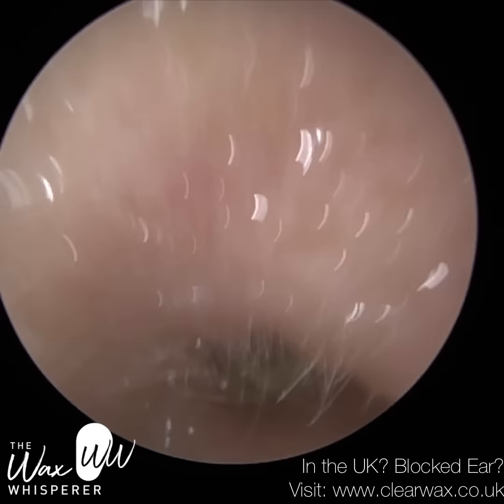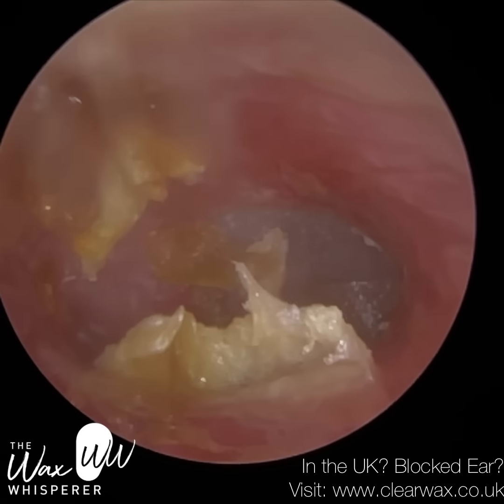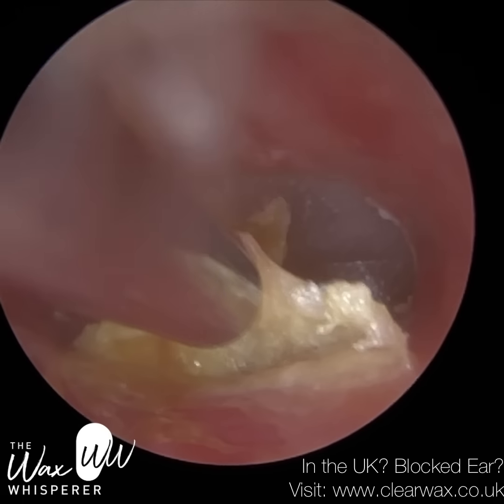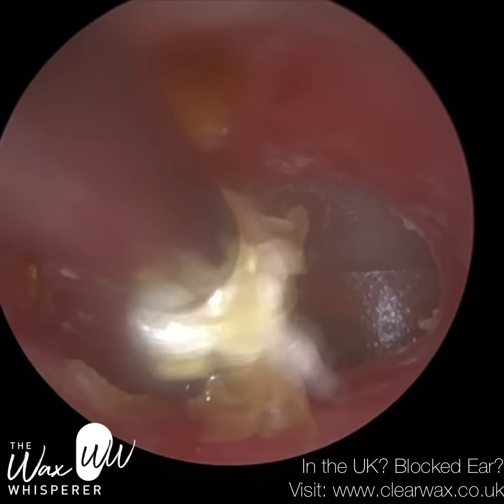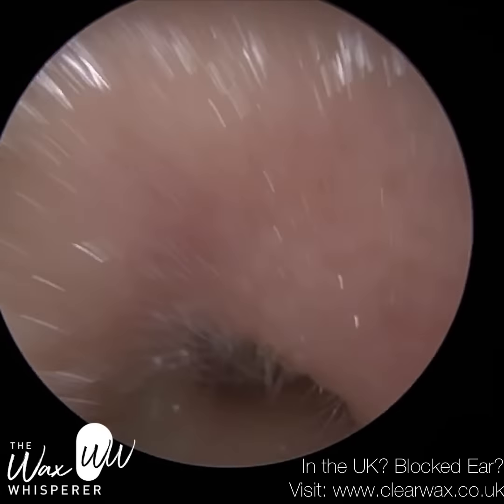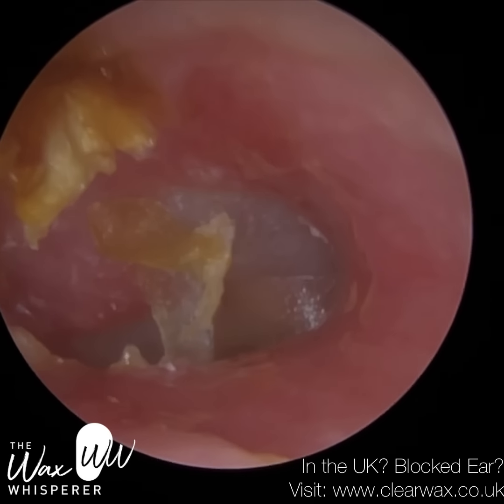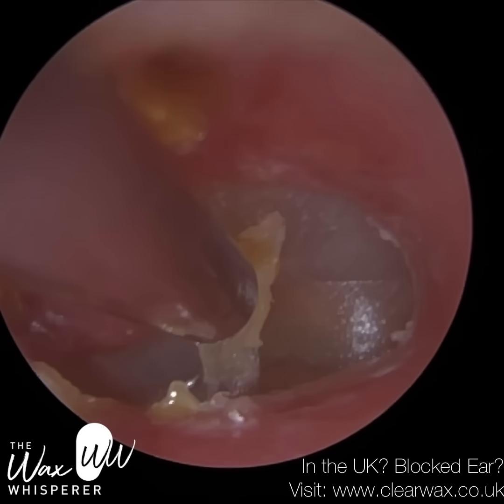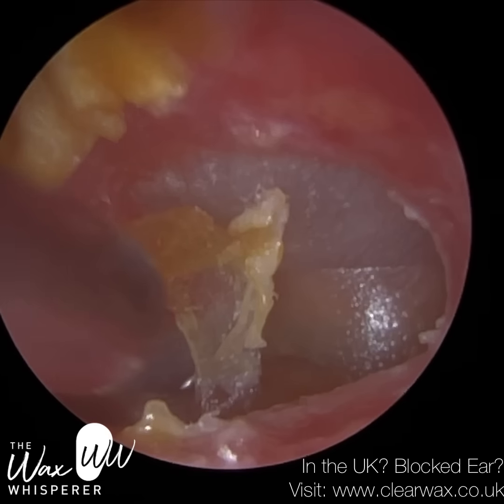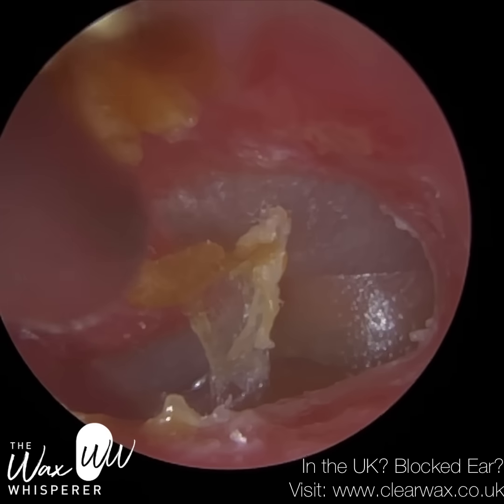I managed to remove it, and you can see it's coated with this dead skin. That dead skin, the rest of it had still remained on the ear canal. So it almost sticks to the ear canal because the skin is attached to the canal and also the plug, and there's a skin on the eardrum that was also attached to the plug of Keratosis Obturans. So the ear doesn't want to let go of it. The skin acts like double-sided sticky tape. It sticks to the skin plug, and it also attaches to the eardrum and the canal wall.